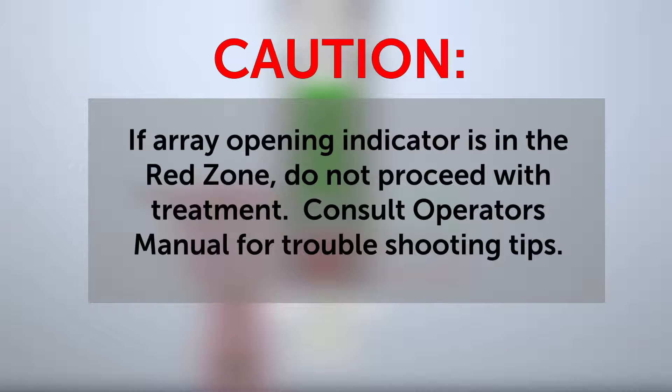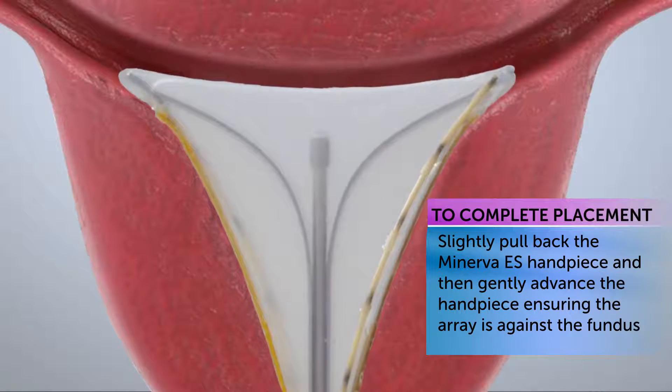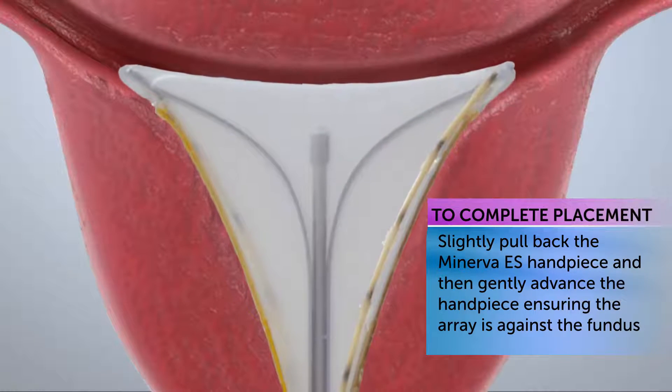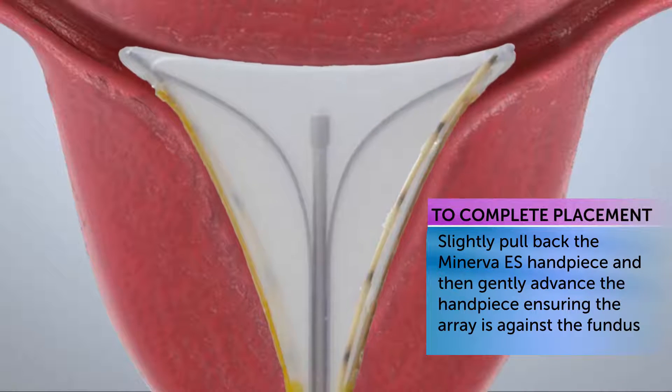If the array opening indicator line is in the red zone, do not proceed with treatment. Consult the operator's manual for troubleshooting tips. To complete placement, slightly pull back the Minerva ES handpiece and then gently advance the handpiece, ensuring the array is against the fundus.